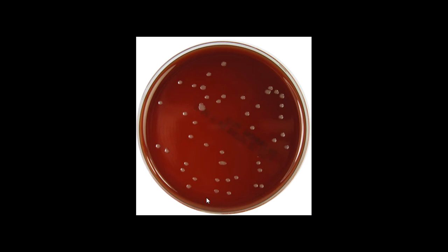So these are the colonies as they appear on this selective media: glistening colonies that are oxidase positive, for example, and then, as I said, growth at 42 degrees centigrade, to be reported as Campylobacter jejuni, for example.